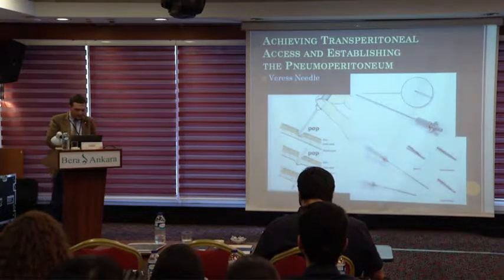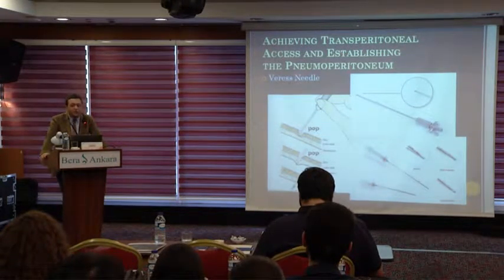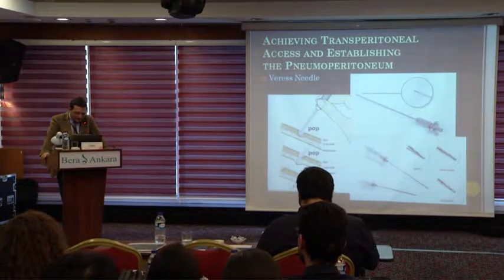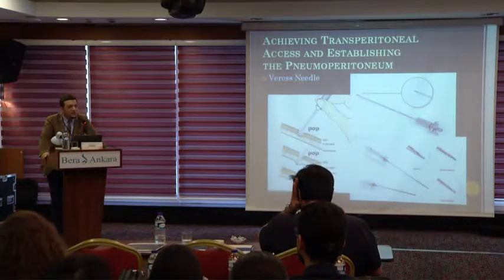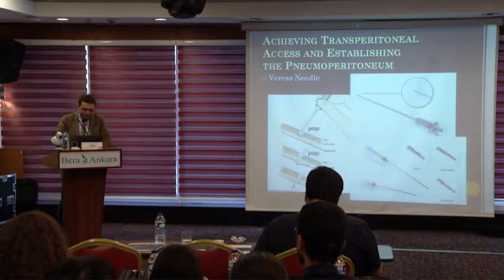And also, the Veress needle is very, very important. It is the most important part of laparoscopic surgery and the most important step, I think, because most of the complications occur during this step. Access can be provided with the Hasson open technique, but we should know the Veress technique too.